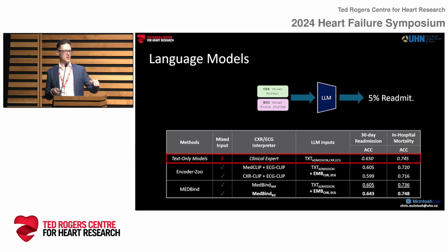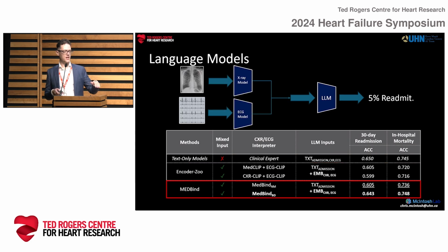mortality. Then we switch to our model, which instead works with the modalities. We've replaced the actual human reports, so the report from the x-ray and the report from the ECG are now gone, and we've replaced them with the x-ray models and the ECG models separately, feeding into that same type of language model, and we hit the same accuracy.